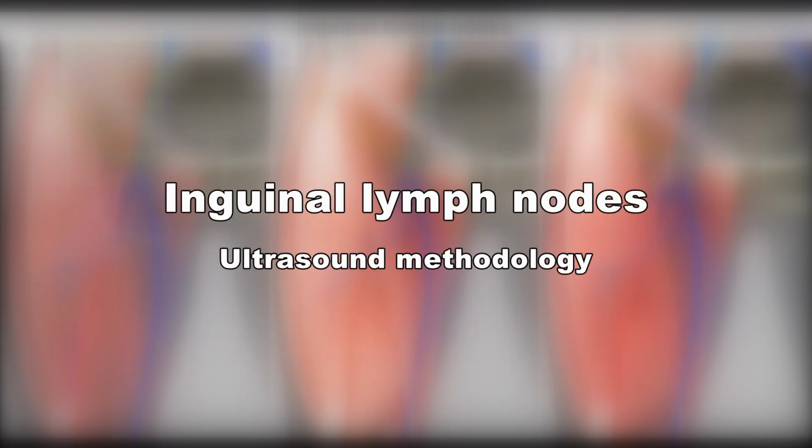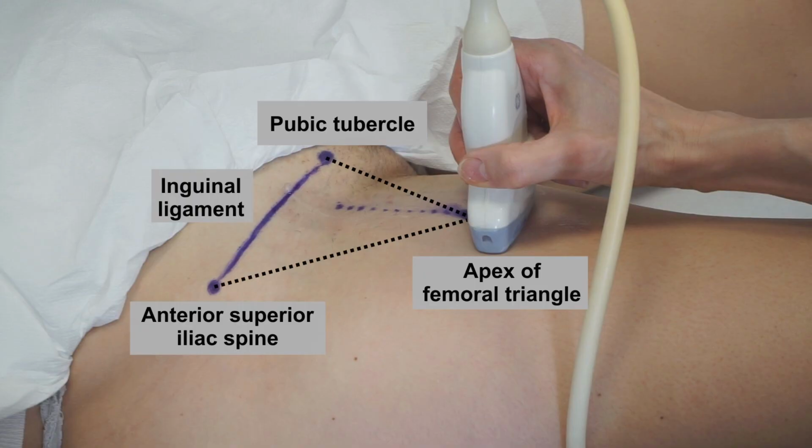In this video, the ultrasound assessment of the inguinal-femoral lymph nodes will be shown. The patient lays in supine position, with the legs extended and apart.